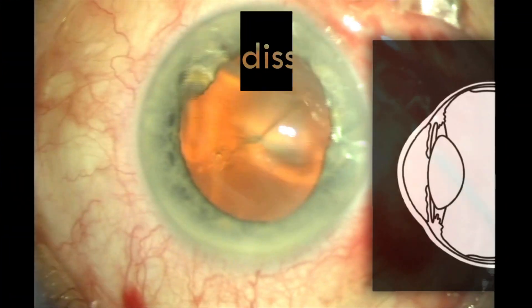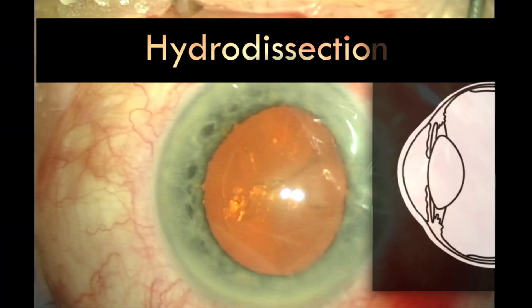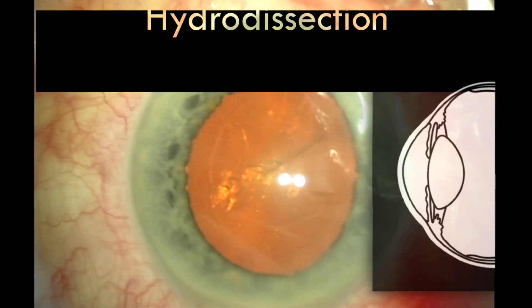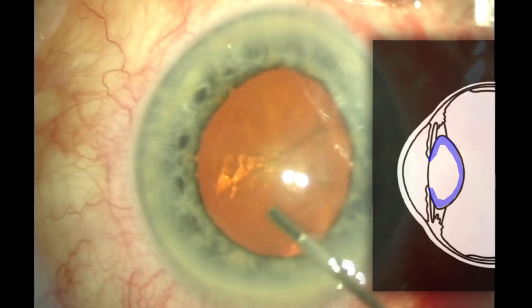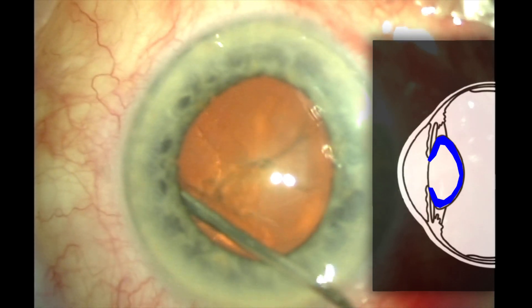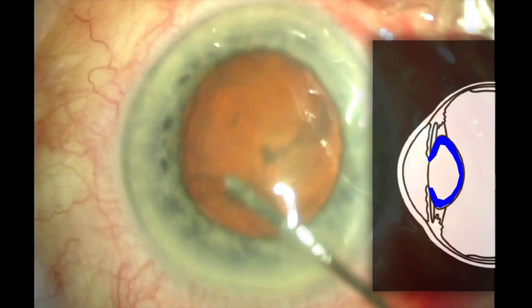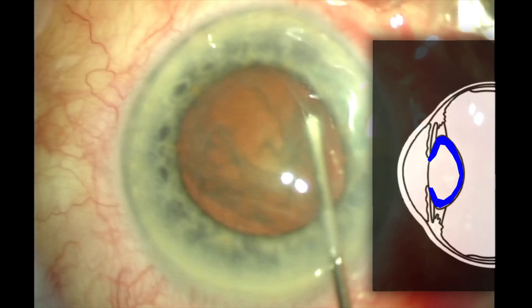Now that we have access to the cataract, we need to gently separate it from the capsule using a technique called hydrodissection. I'm using a blunt cannula, going just under the capsule and injecting fluid to loosen and free the lens. This will allow me to manipulate and rotate the lens, which is essential for the next stage.